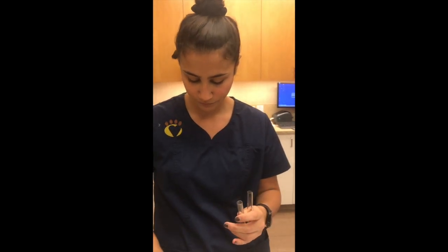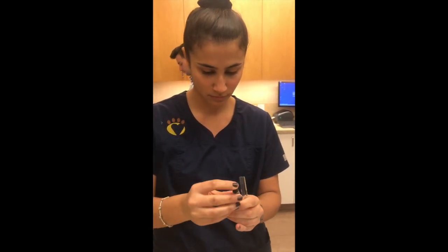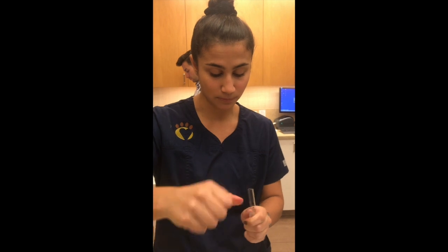Perfect. And now with our recipient serum, I'm going to add 2 drops into our new test tube.